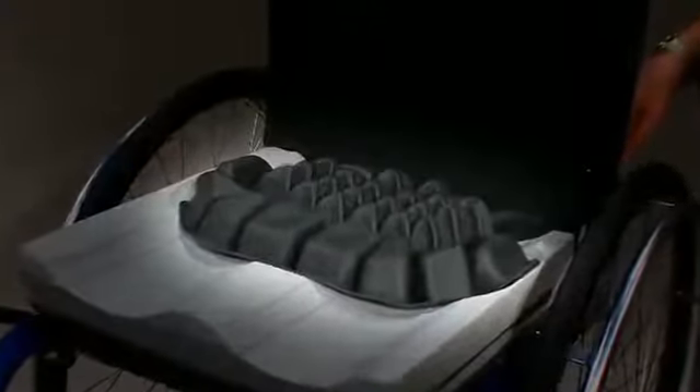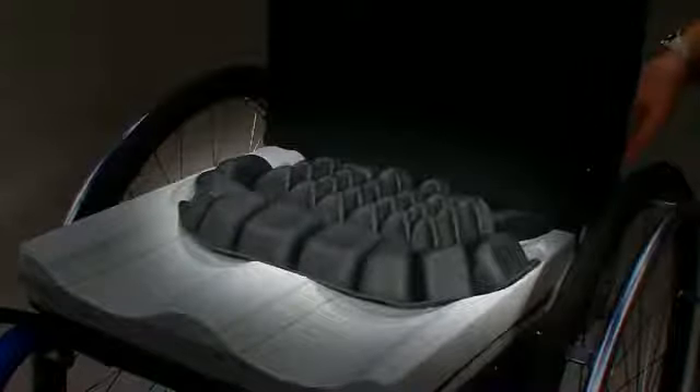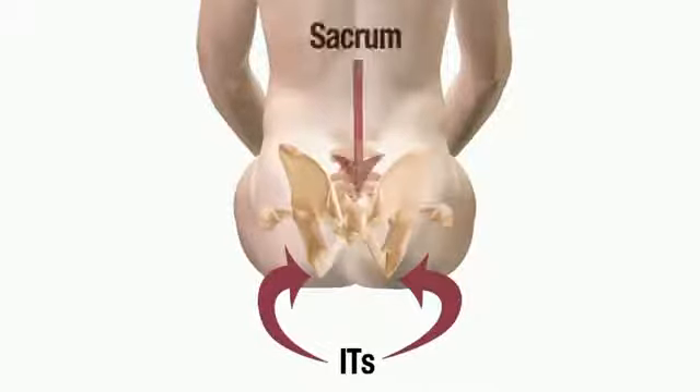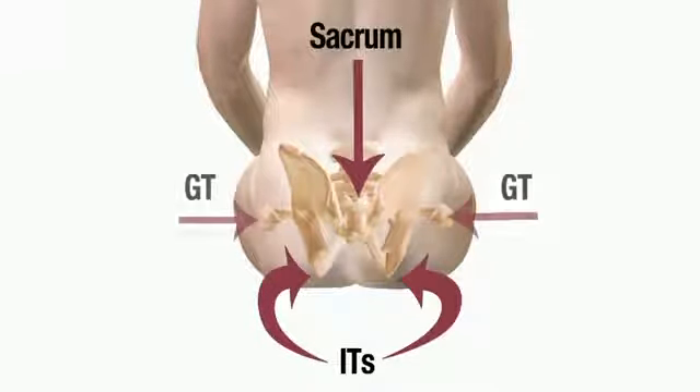While sitting on the Hybrid Elite cushion, the individual's entire pelvis is protected by the Roho Air Cell Insert. This includes the ischial tuberosities and sacrum of the pelvis and the greater trochanters of the femurs. This allows the entire pelvis to be hydrostatically loaded or floating.